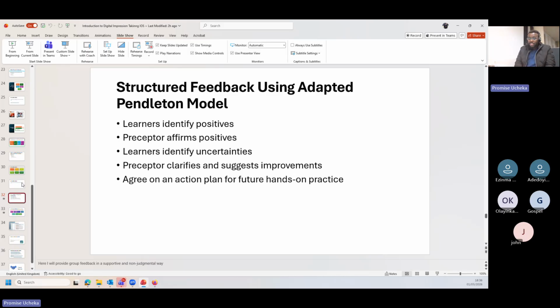There could be contraindications. There are patients with limited opening. Let's say a patient has a temporomandibular joint disorder that doesn't allow them to open their mouth fully, and you can't get that scanner into the mouth of that patient.